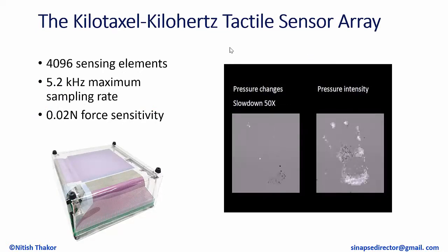So this is a graphic of the sensor. It's a two-dimensional array. And so if I put my hand on it, it creates a nice two-dimensional pattern of the hand. Again, you can see that it is being encoded in digital format, which means that those colors represent the applied pressure but spikes the digital activity. Secondly, it encodes for slow and fast information. So slow pressure will be retained, but fast will look for change. And you can adjust the sensitivity of it, which is also quite remarkable, right? That you can do a very light touch on your skin and feel it, and you can also tolerate a huge amount of pressure. So our skin has huge dynamic range. Commercial, industrial sensors don't do that.